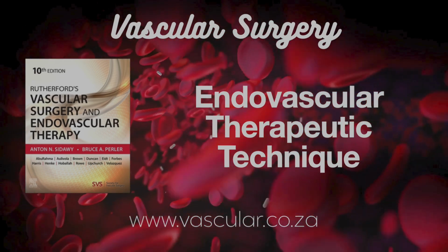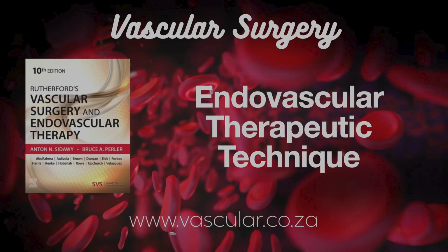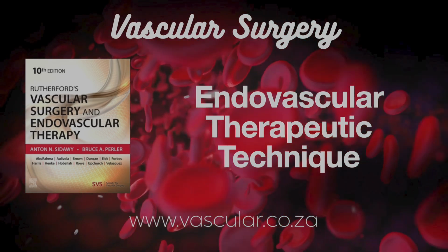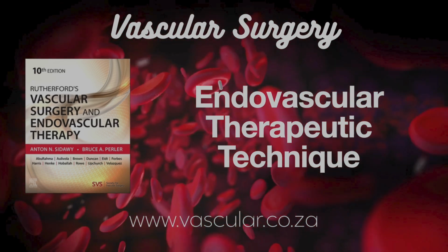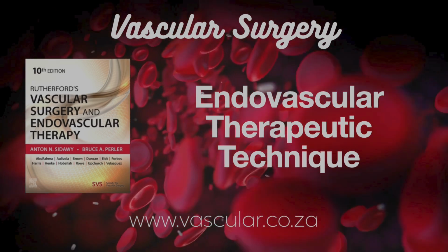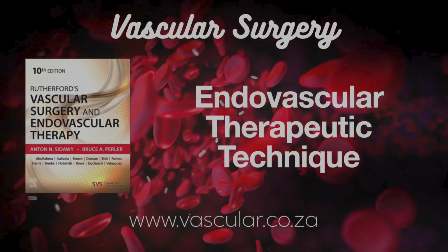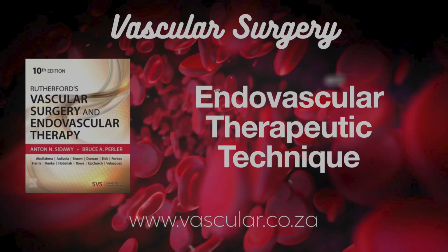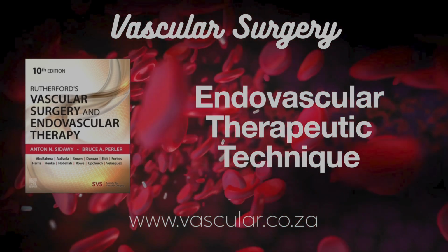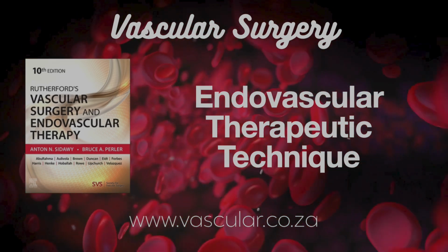Its main FDA approval is actually for airways, tracheobronchial strictures, but it's used off-label in blood vessels frequently. For iliac and renal blockages, vessel perforations, in-stent restenosis, even reconstructing side branches during complex aorta repairs. Main advantage, disadvantage? Advantage is often a relatively low delivery profile. Disadvantage is rigidity, less suitable for twisty vessels or areas that move a lot. Long-term data for peripheral blockages is still a bit limited, but one iCast study showed around 75% primary patency at 5 years.